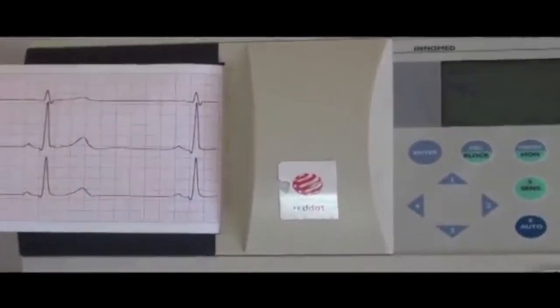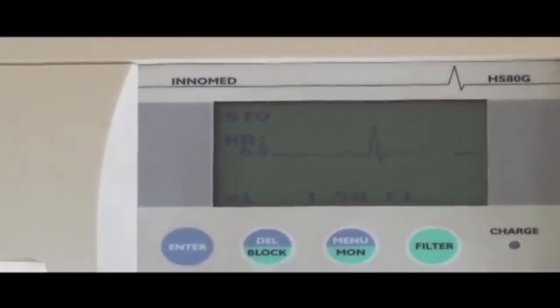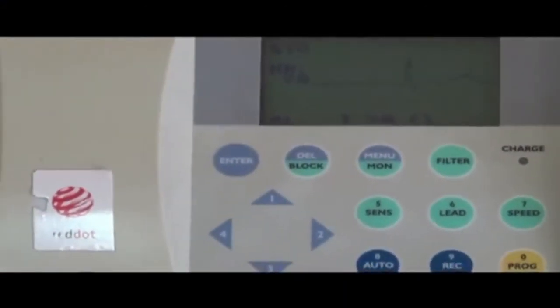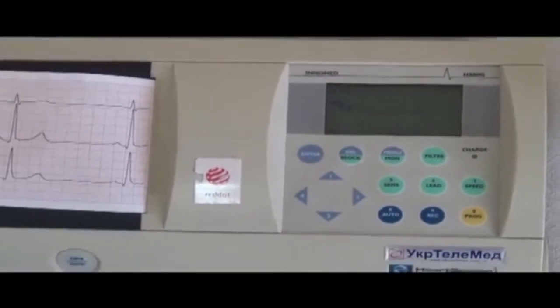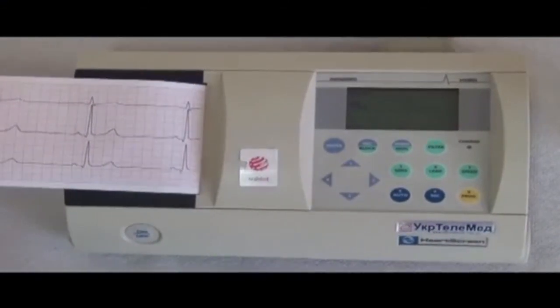Ask the patient to breathe normally, then turn off the tape. We will analyze how the graphics of the third standard lead change at the height of inspiration. The third standard lead reflects the potentials of the posterior wall of the left ventricle and depends on the position of the diaphragm, so complexes in this lead can change at peak inspiration.